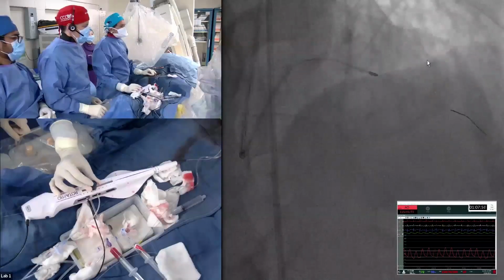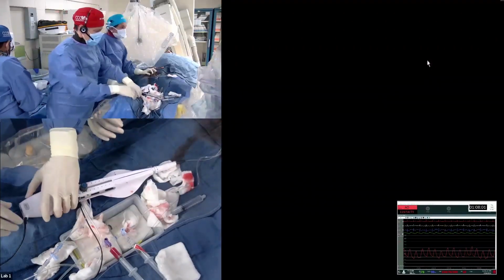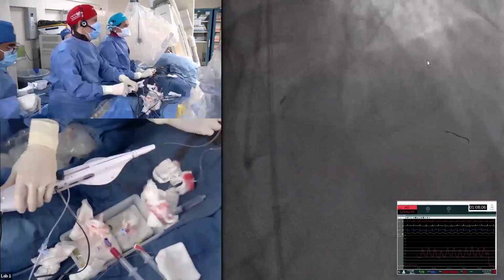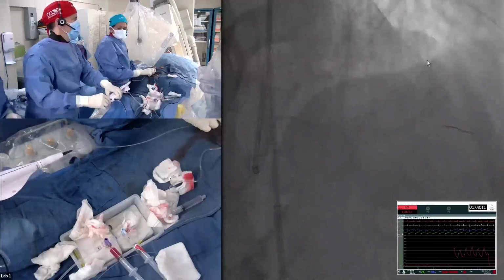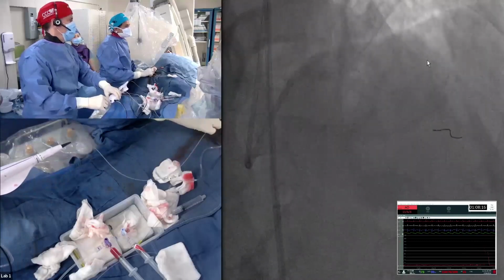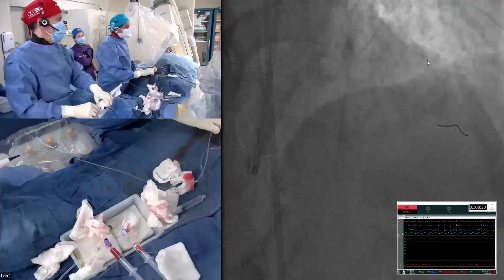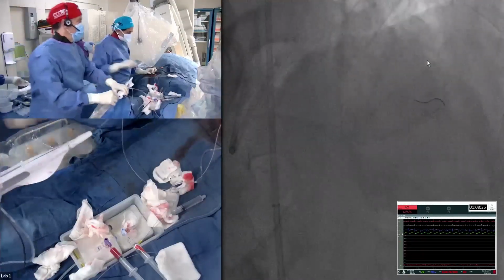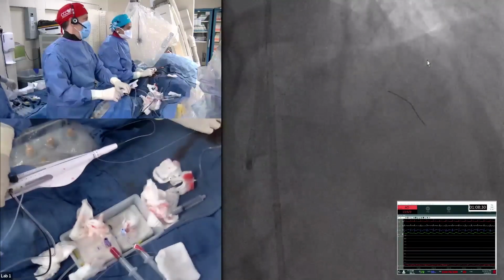Okay, yeah. Give me the wires quickly. Ready? Wire coming out. Ready. Yes. Again, for the audience, exactly, it's not unusual that sometimes you don't get through it in 2 or 3 passes and you're getting stuck there, it's not unusual to go up on the RPMs. You know, the fact there's no EKG changes, everything is going good. I don't think you disrupted anything in the LAD. Again, it looks quite stable on the IVUS, which is good.